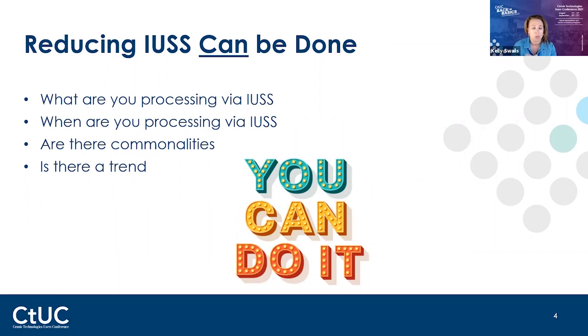Yes. At the facility that I was at, we were flashing about 480 times a year. The goal was to get that down to 0. And when I left, we were down to 24 a year. Last I heard, we were at 0. So what I did is start documenting these IUSS loads, put it in an Excel format, run those reports, and look for those trends, look for what's happening here.